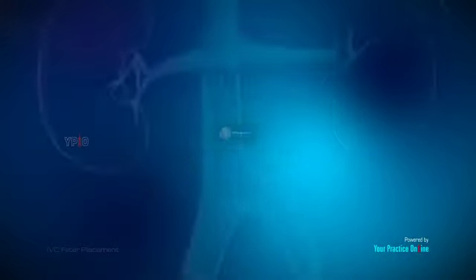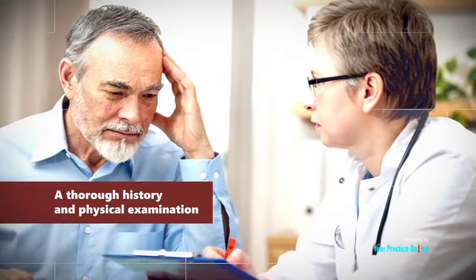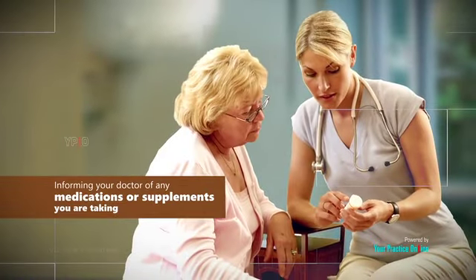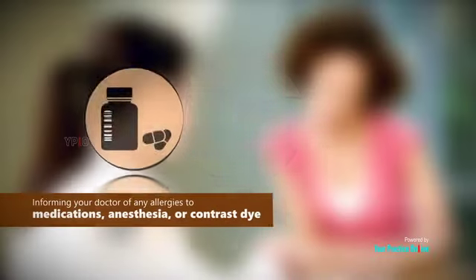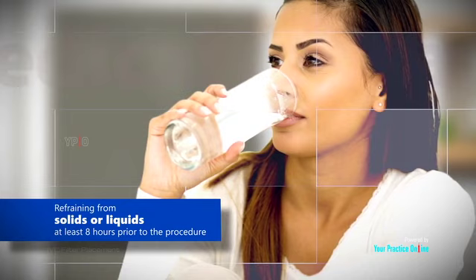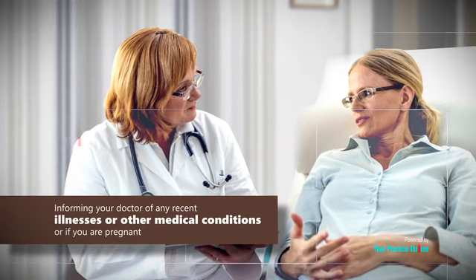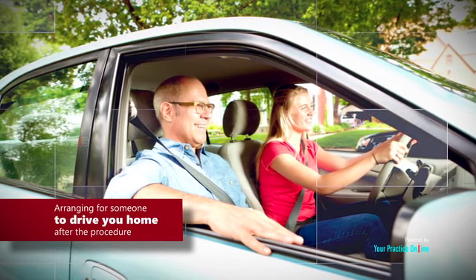Preparation. Preparation for IVC filter placement may involve the following steps: a thorough history and physical examination, routine blood work and imaging, informing your doctor of any medications or supplements you are taking, refraining from blood thinners, aspirin, or NSAIDs if indicated, informing your doctor of any allergies to medications, anesthesia, or contrast dye, refraining from solids or liquids at least 8 hours prior to the procedure, informing your doctor of any recent illnesses or other medical conditions, or if you are or may be pregnant, arranging for someone to drive you home after the procedure.